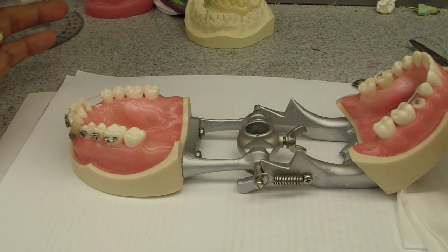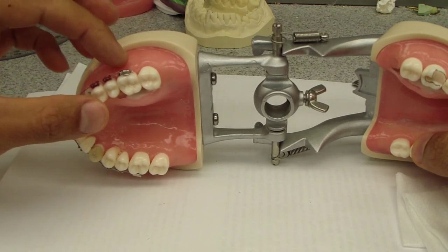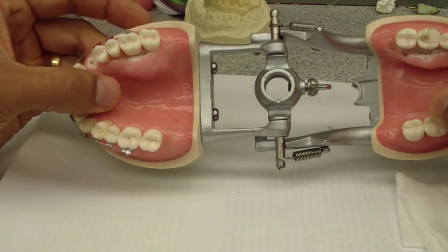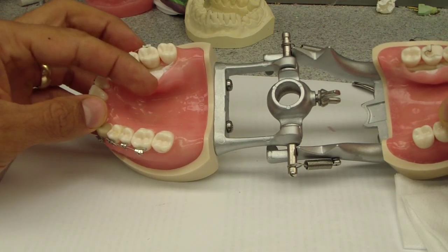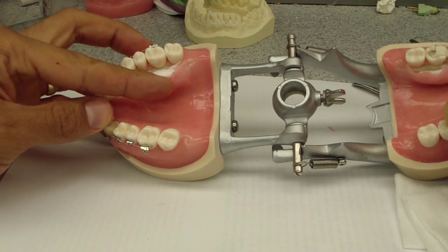Preservation of furcation is a huge factor, especially when you have really thin cortical plate — we can discuss that more at a later point. But when you are doing that palatal procedure, the tissue after you elevate it is fairly thick, it's well bound down, it's tough to manipulate, and especially tough to keep it away from the tissue.